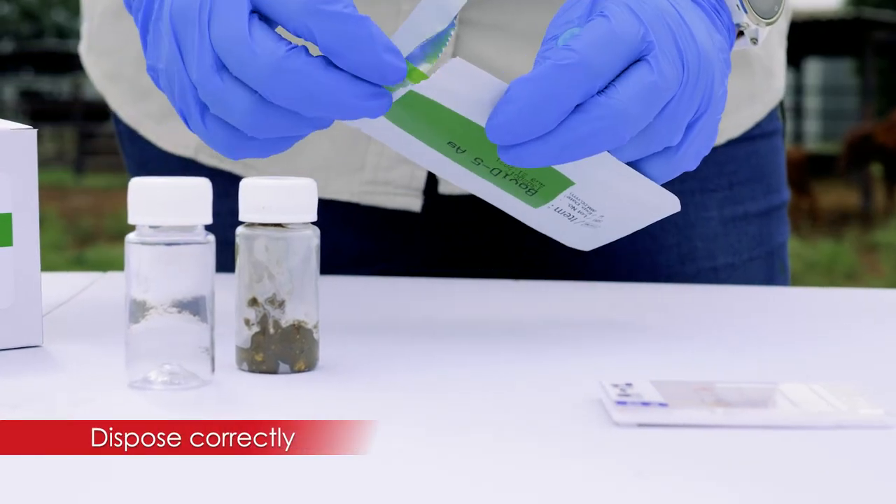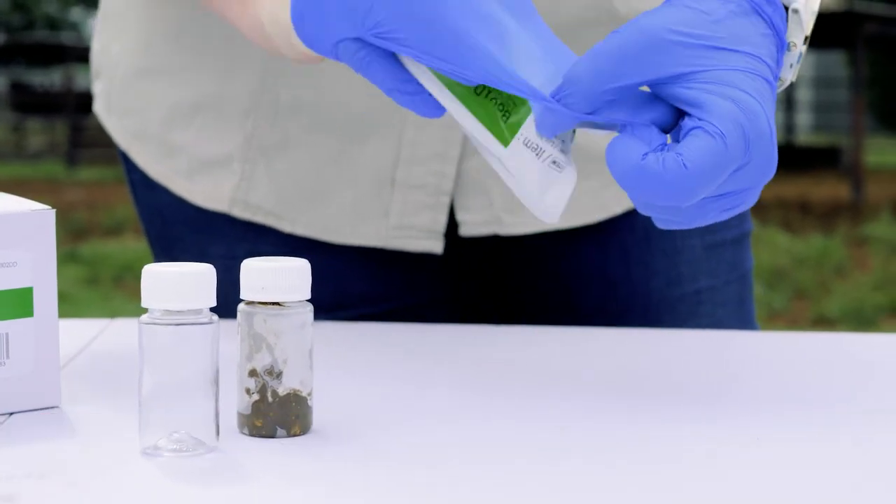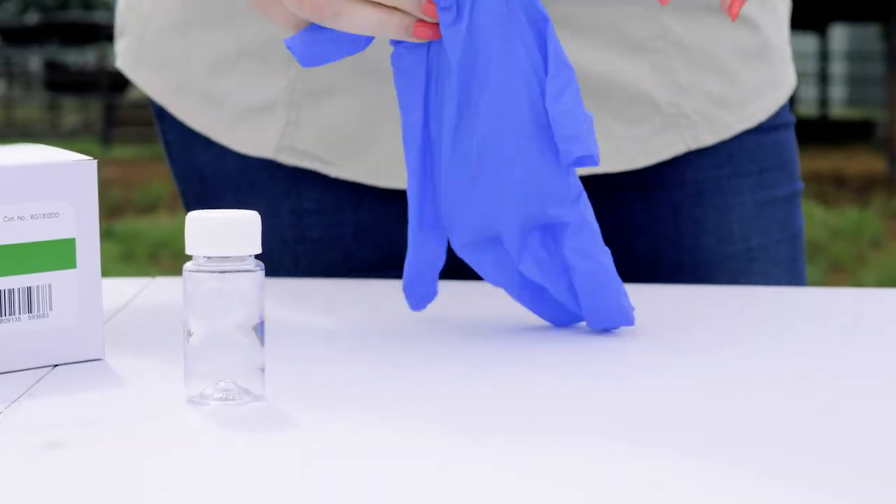Because we're working with contagious diseases and you don't want to infect the area you're working in — especially not the farm — for biosecurity purposes it's important to dispose of the test in an appropriate manner and to keep it away from children and animals.